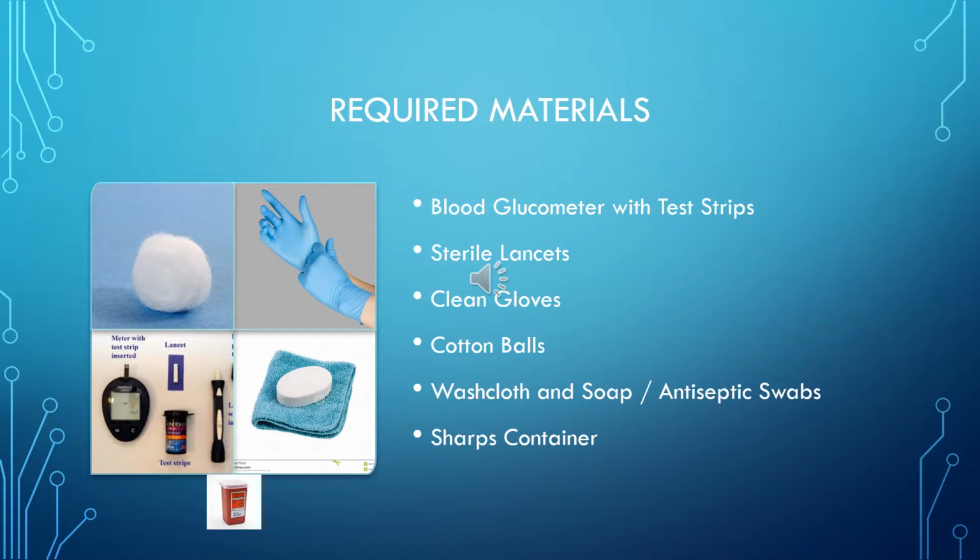And very importantly, when we're teaching our patients, we need to be aware of what type of glucometer they're using in the home setting. Preferably, they'd bring that in when they come to see us. So that way we can cover the exact procedure that's used for that type of equipment.